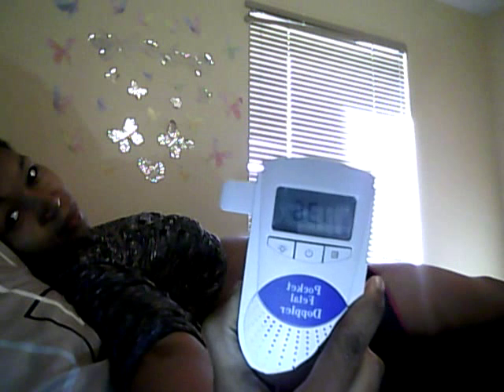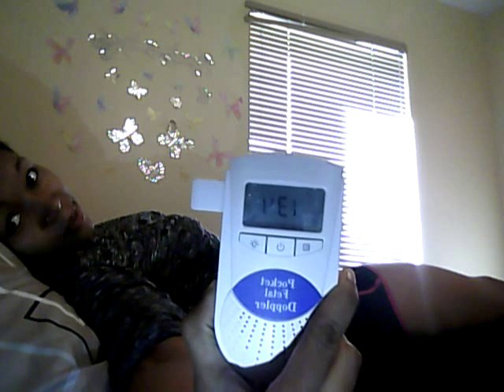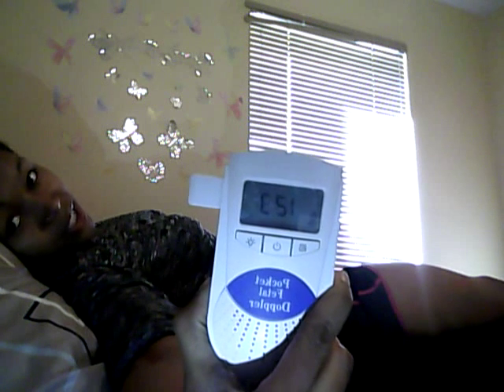This guy now, just gotta find a heart. Trying to figure out if this is... I guess right now, yesterday it was like 161, between 150 and 160, depends on where. It just changed to 150 something, so.